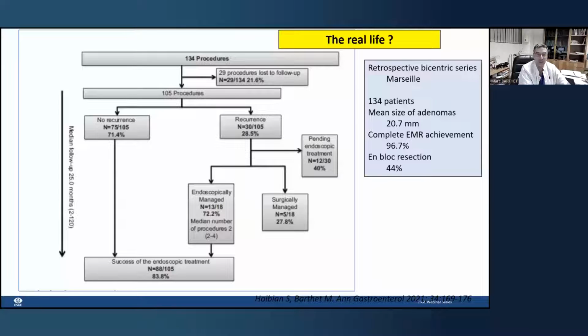surgically managed were 27% of the cases. So finally, adding the treatment of recurrence and adding the primary positive results after endoscopic resection, the success of the endoscopic treatment was 83% of the cases. So thank you. This is my presentation about the real life in Marseille.